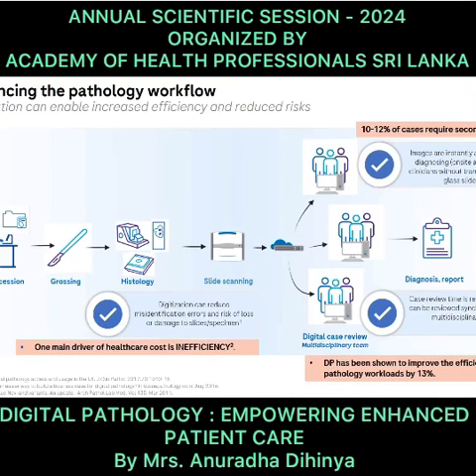When a glass slide has to be couriered to a different hospital setup, maybe one not in Colombo but somewhere else, and you want an opinion on that particular case, the digital slide images can be immediately transferred to that hospital or institution if you are collaborating with, say, the US or Europe. Those cases can be digitalized and transferred, and we can give the pathologists there access for, say, 1 day or 2 weeks, whichever amount of time you want to keep it, and they can see the cases, report them, and share that opinion with you.